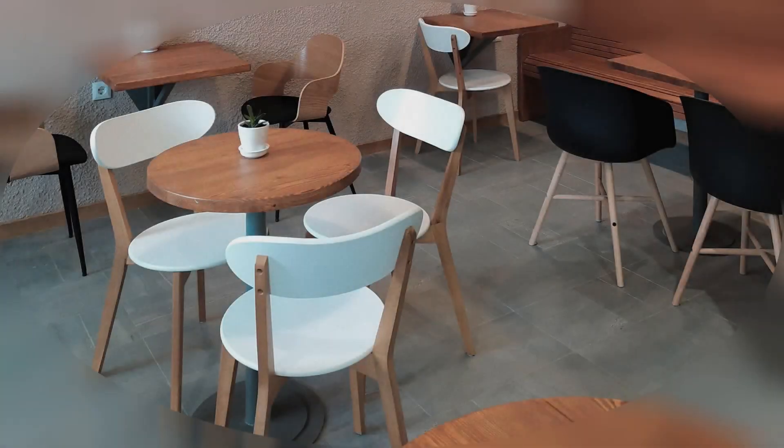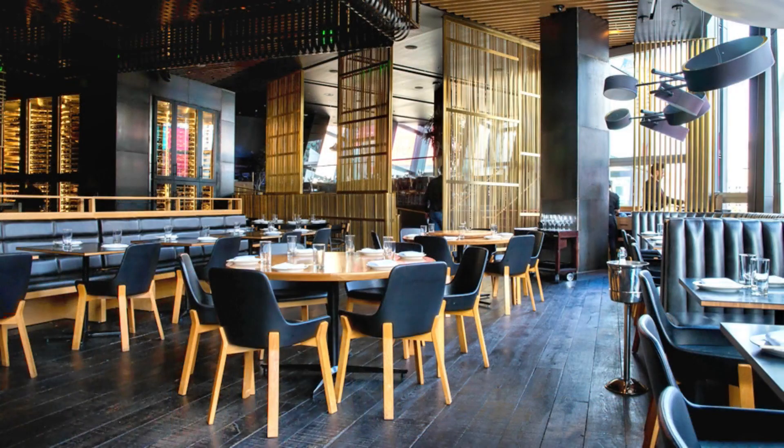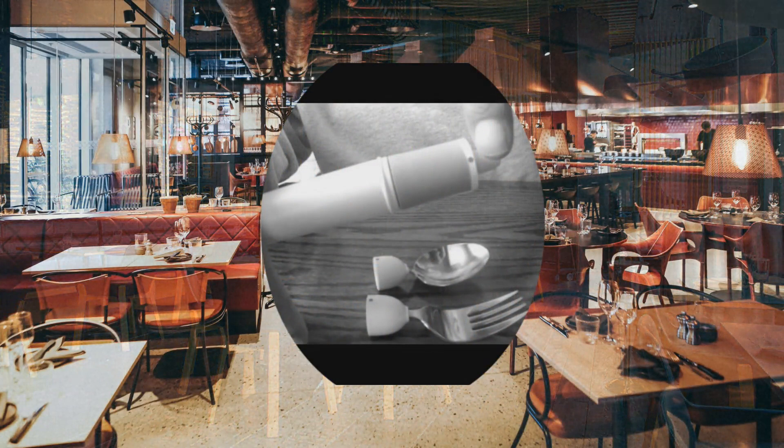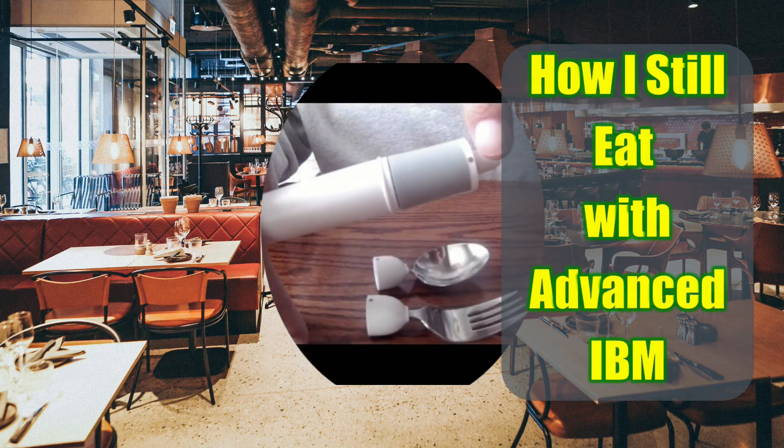There will come a time along your IBM life journey when the simple task of getting food up to your mouth becomes difficult. This episode will review how I get food to my mouth with an innovative eating device that I purchased 3 years ago and the ways I had to modify how I use it, even while deep into stage 3 of the skeletal muscle disease called inclusion body myositis.